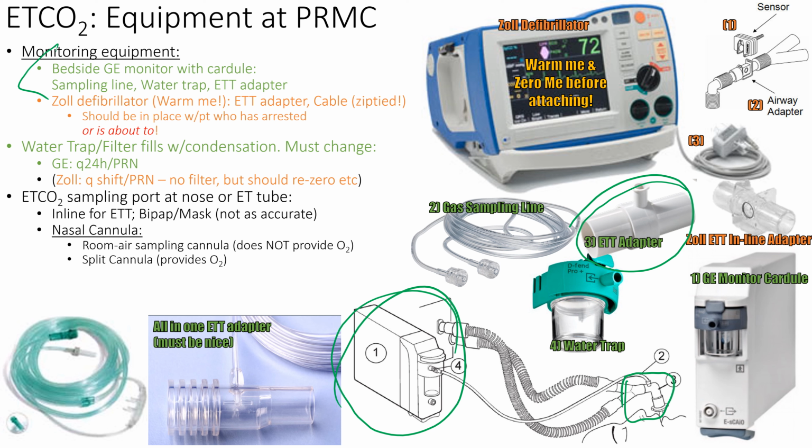So yeah, you need a sampling line, the water trap, and the ET tube adapter, and sometimes all you have to do is hook it up right to the HME. Okay. So the Zoll defibrillator, you have to what? You have to warm it up before you attach to it. Okay. And it should be in place for patients who arrest, right?